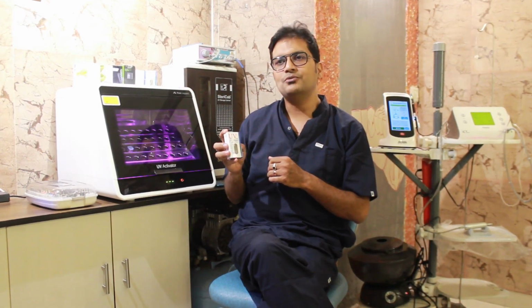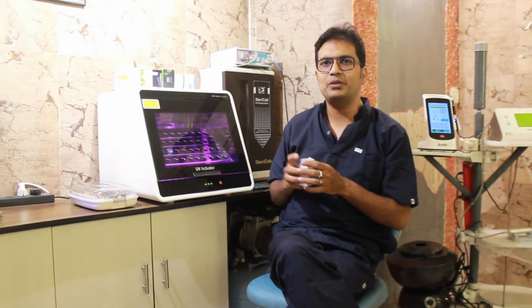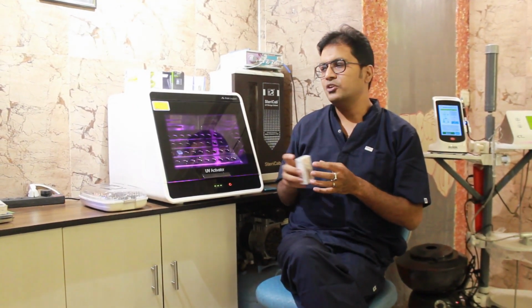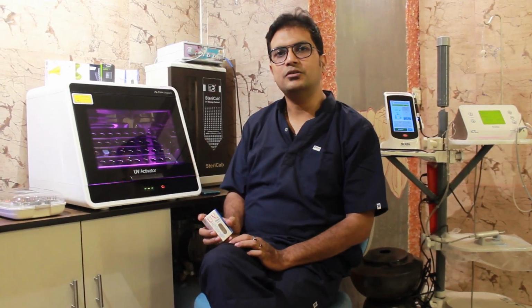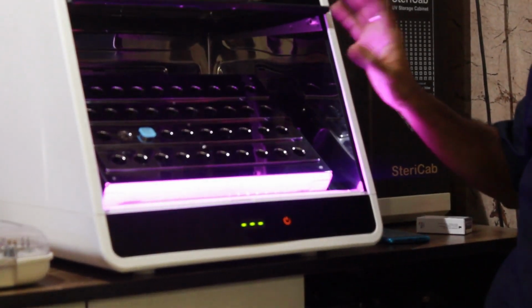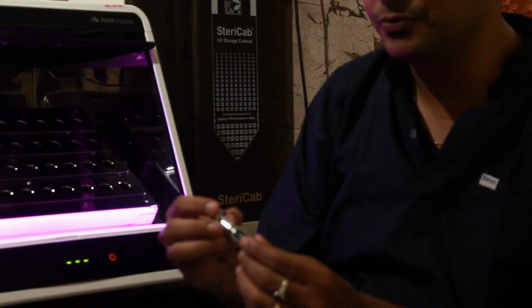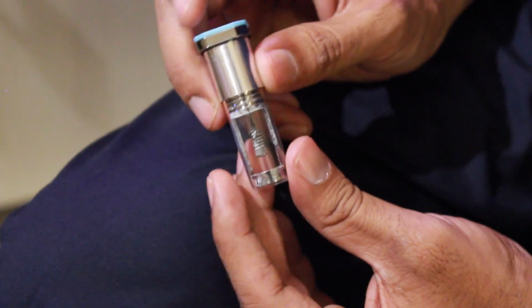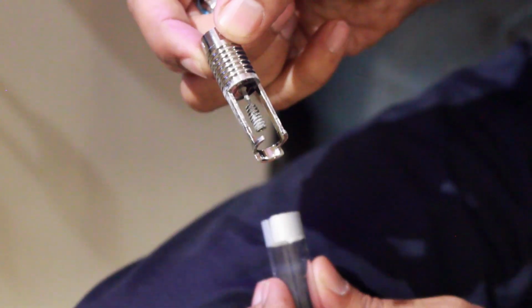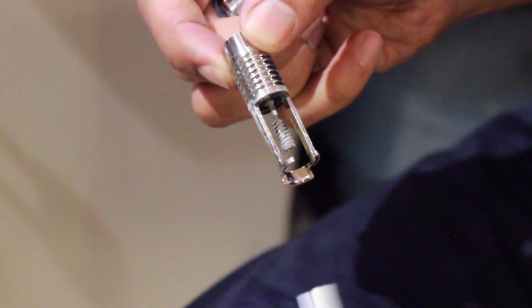So now let me show you what a UV implant looks like when we take it out of this cabinet. We have already placed an implant for 24 hours. So let me take it out and I'll show you what the UV implant actually looks like. This is our cabinet where we activate the implant. Here is an implant which we have activated for you. So this is an activated UV implant, which was in this box for 24 hours, and now it is almost ready to be placed in the mouth.